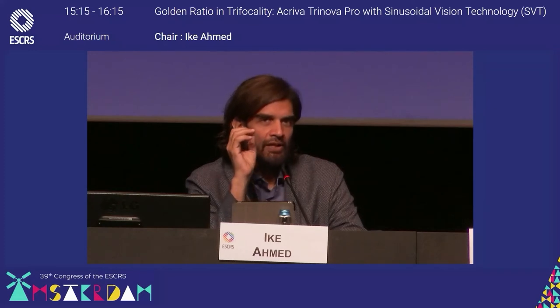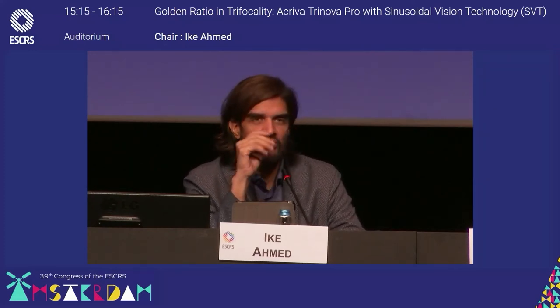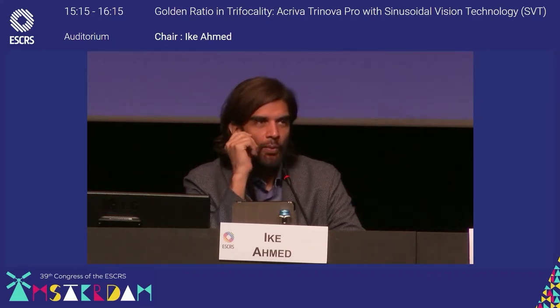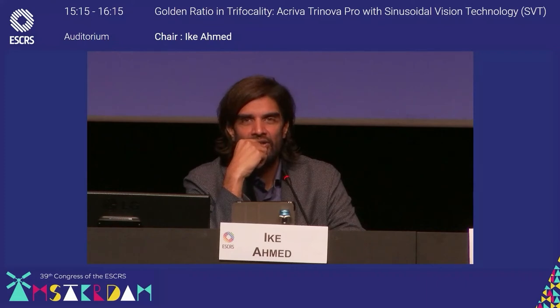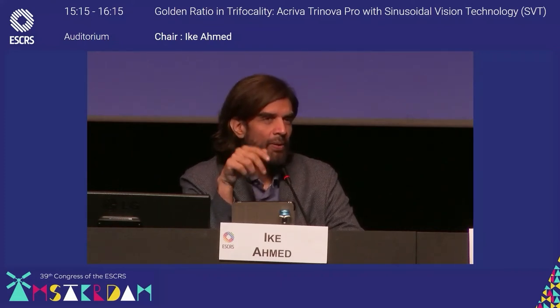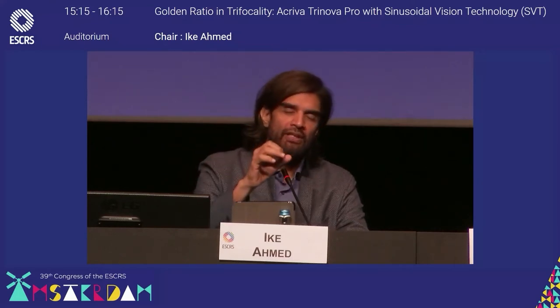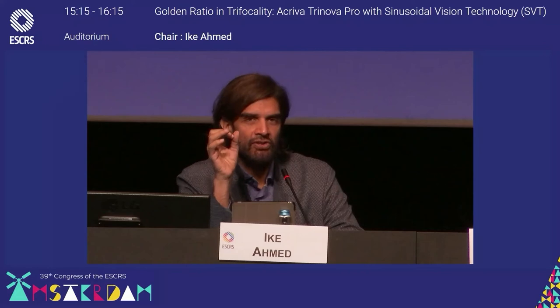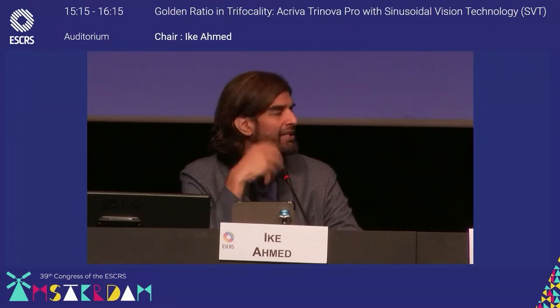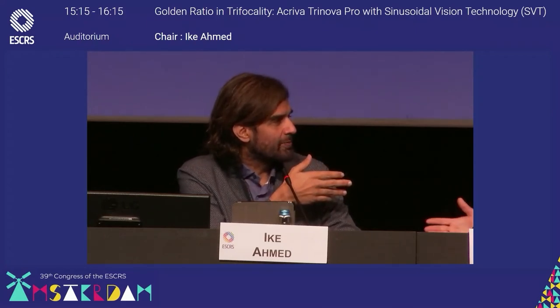But I do feel good about using the coaxial light from the microscope, preferably stereo coaxial. That's kind of the line of sight. Patients fixate on it, and we all want to try to center this lens on the line of sight. That's what I typically try to do. We all know the pupil centration compared to the geometric centration of the cornea, with the line of sight in between. I don't know if you did that in your case, Karsten, you had perfect centration afterwards.